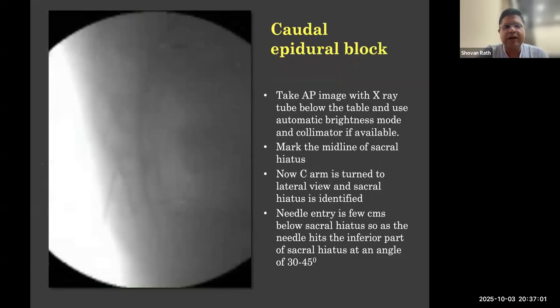otherwise, if you want to go for an interventional approach, then we try with a caudal epidural, because almost 1 to 1.5 ml or 2 ml maximum you can see for each level. So almost 10-15 ml of drug will reach almost the targeted levels.